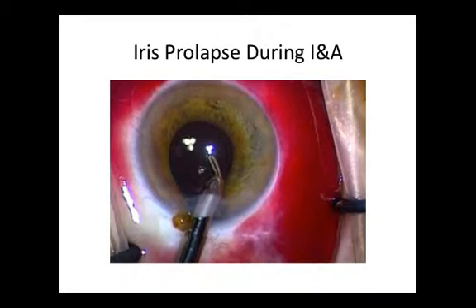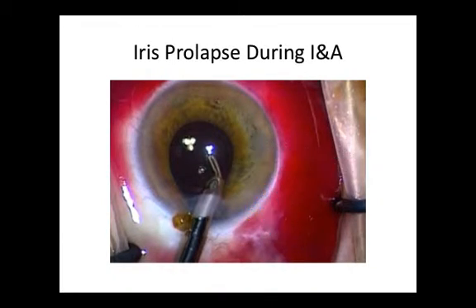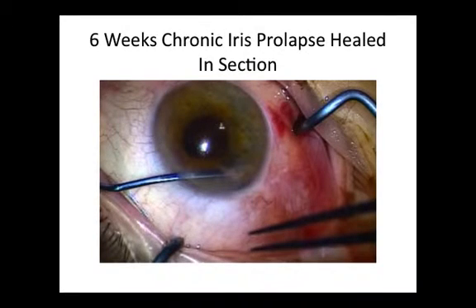However, if prolapse such as this has occurred early on, it is always better to stop, remove the instrument, replace the iris gently, and then either close the section and re-utilize another section, or possibly use iris retractors to tighten the iris and pull it posterior to the corneal section.